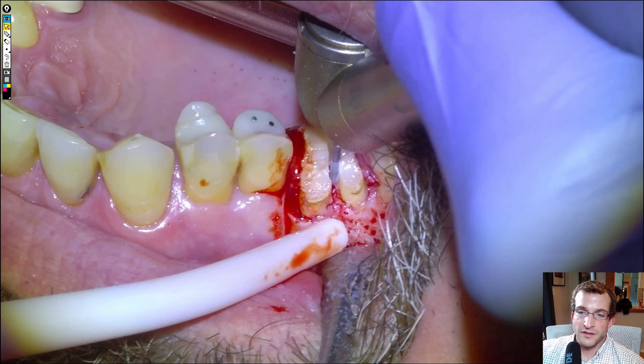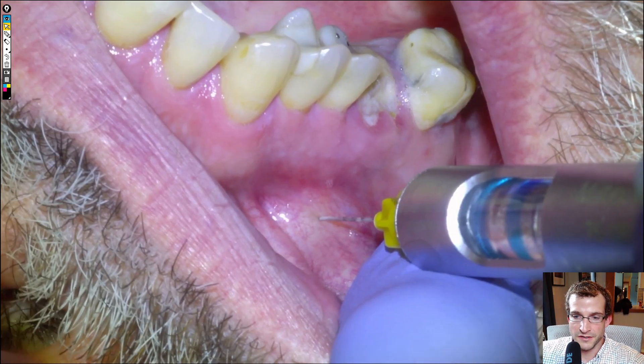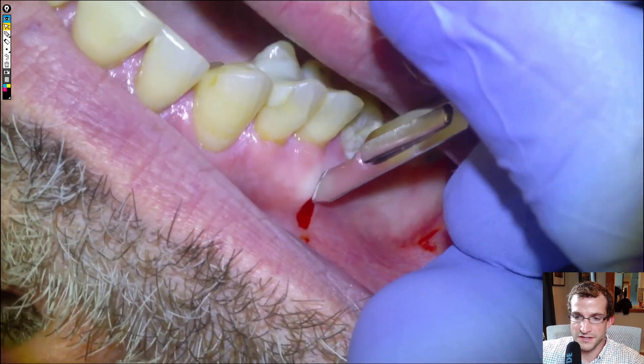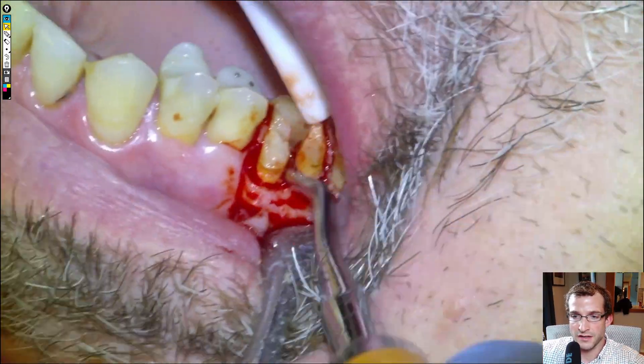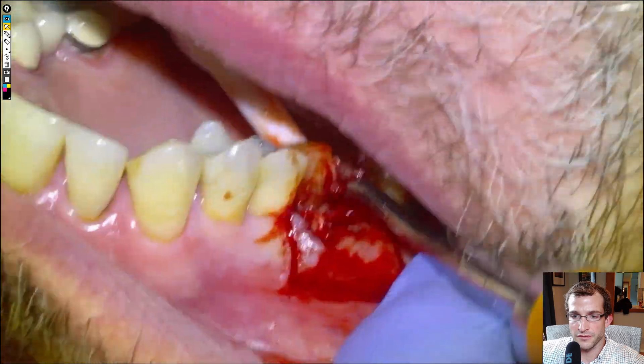Hey everyone, Dr. Dobson, and we're going to be surgically extracting a 1-6 in this video. Here's an overview: we're going to go over anesthesia, incisions, flapping, sectioning, and elevation of the roots individually.